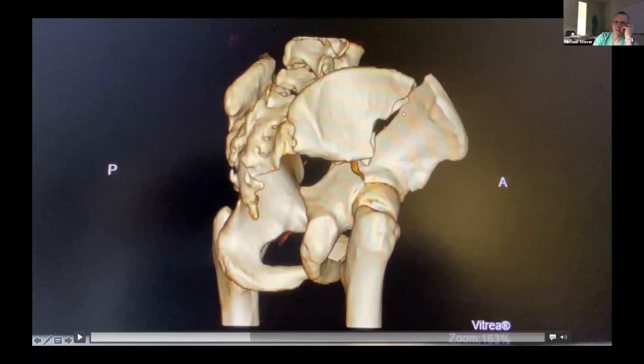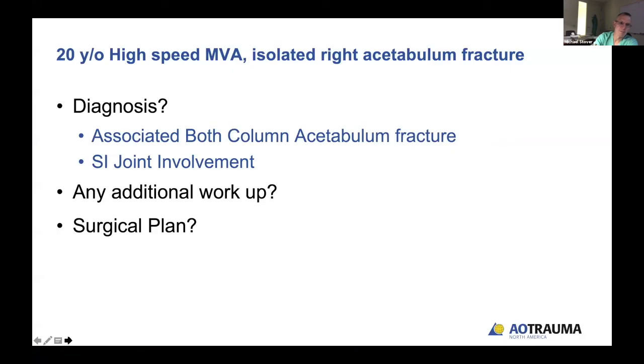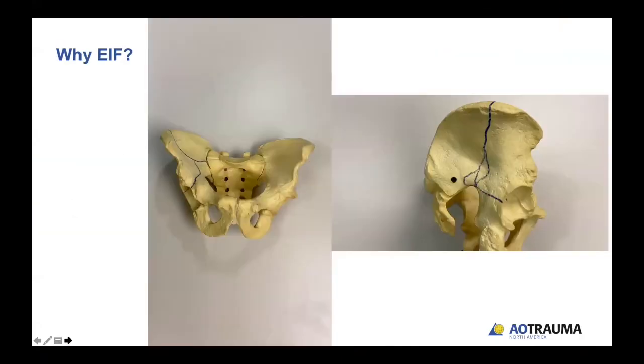So you would start with your reduction here, with traction, of course, as Keith pointed out, reduction at the crest, reduction along the outer aspect of the bone here. You'll see there's a couple of mini fragment screws that I placed to hold these fragments back along the obliquity of their fracture lines to help get this reduced, and then reduce the posterior column to that. And just a 2-screw technique to distract the anterior column and disimpact from the front of the sacrum? Yes.